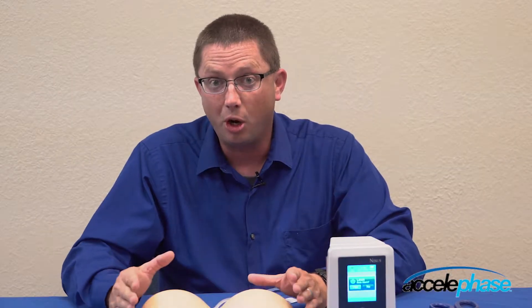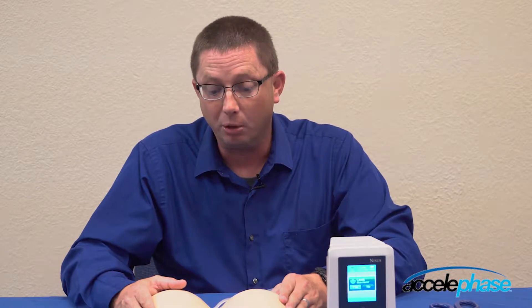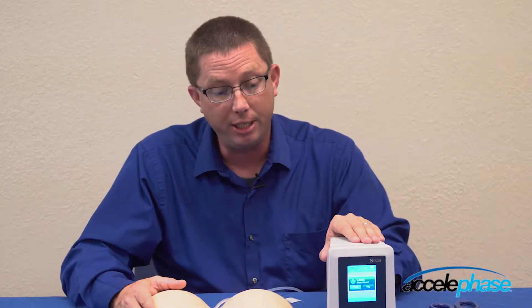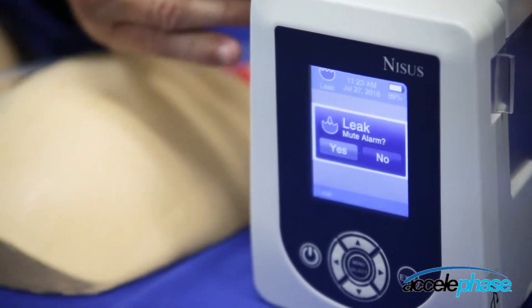This video is going to instruct you on how to identify a leak alarm and how to rectify the leak alarm. As you can see on the Nisus negative pressure device, our pump has detected that there is a leak alarm.